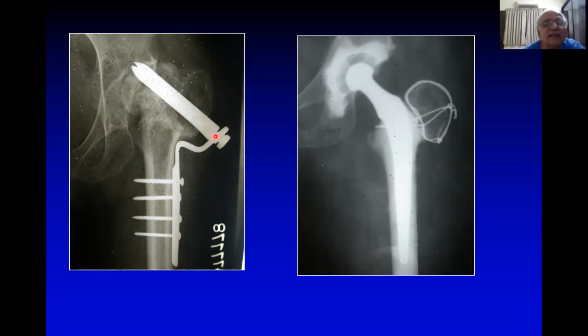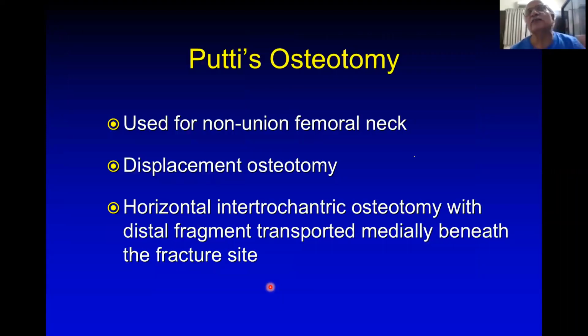There were 2 or 3 displacement osteotomy plates, and we did it totally because we can't enter, so we have to detach the trochanter. And this is a Chandler trochanteric wiring, and we were able to do it totally straightforwardly without difficulty, because again, there is no problem in the sagittal and coronal planes. So you will be able to do it. So that's about the McMurray.